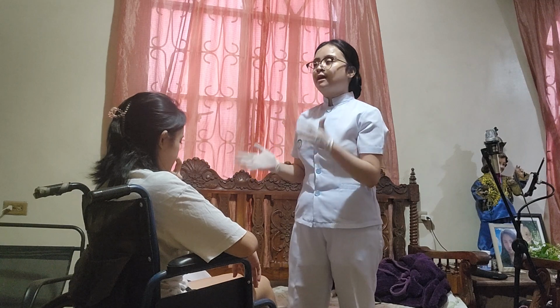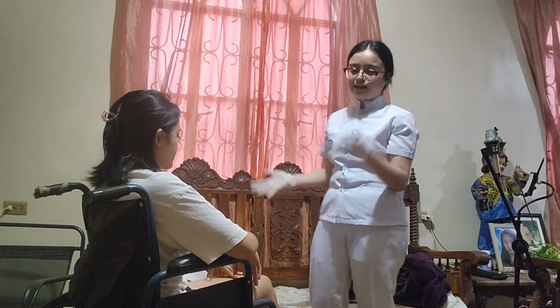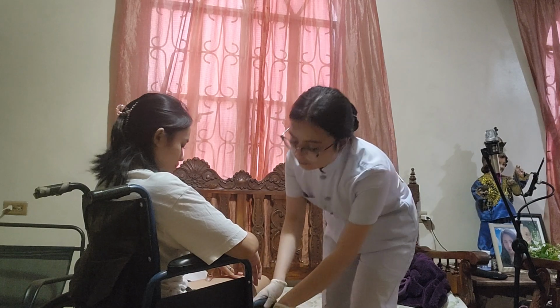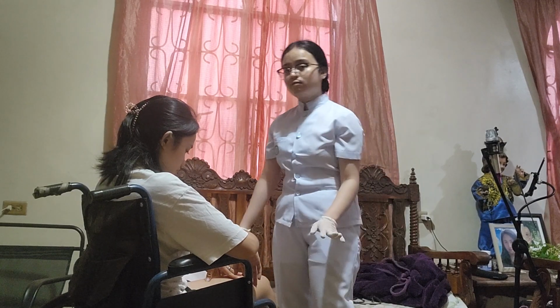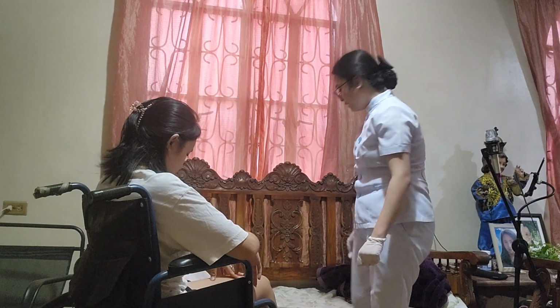Now, after the procedures that the patient will do, I will be transferring my patient from the wheelchair to the bed. Again, you will need to secure the brakes to prevent falls and risk of injury.